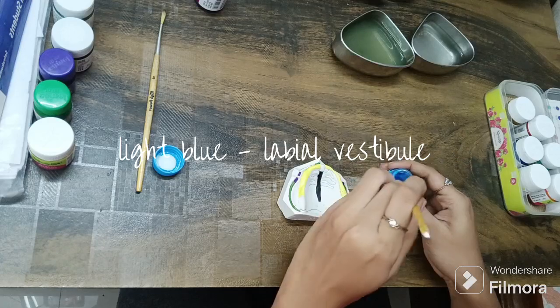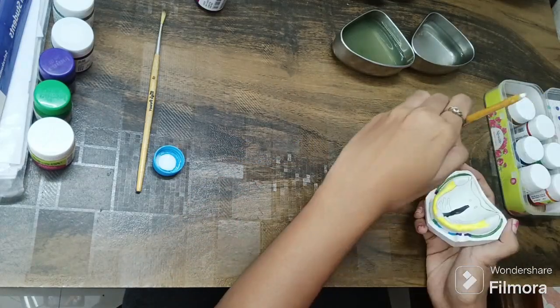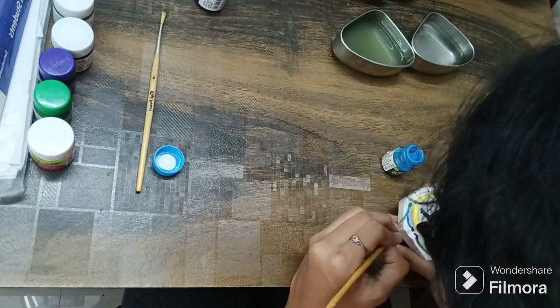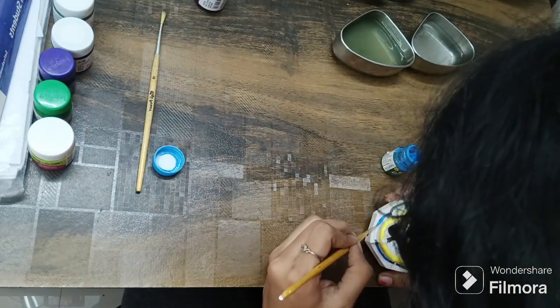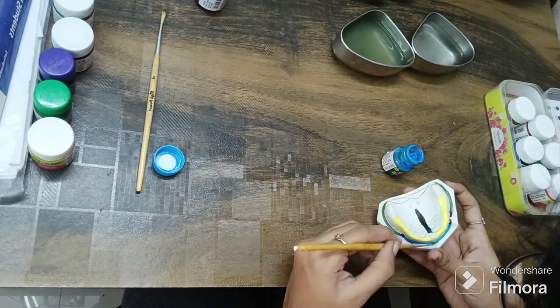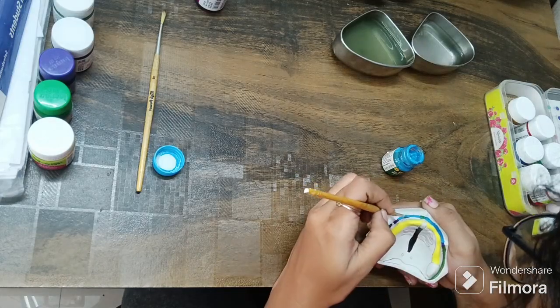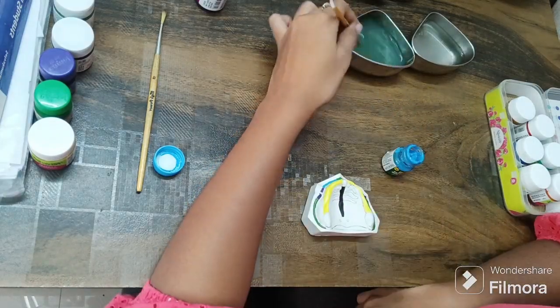This light blue poster color is used for the labial vestibule region. This is also another tricky region as there is a lot of probability for smudging. Give it a second touch if desired — the white spots will disappear if you give a second coat.